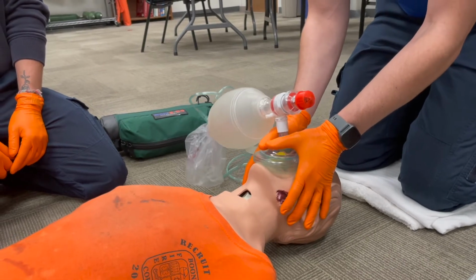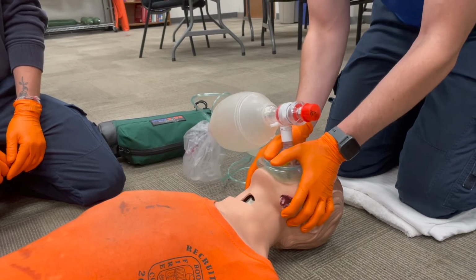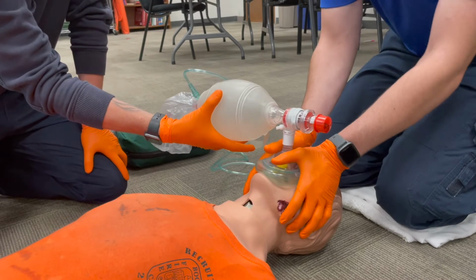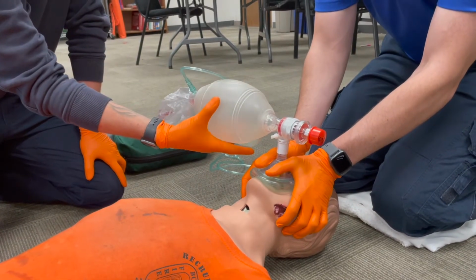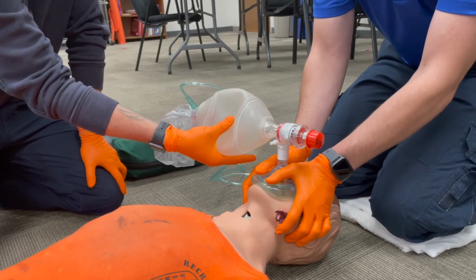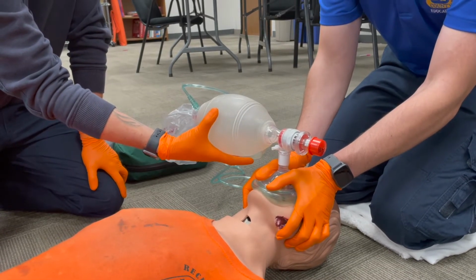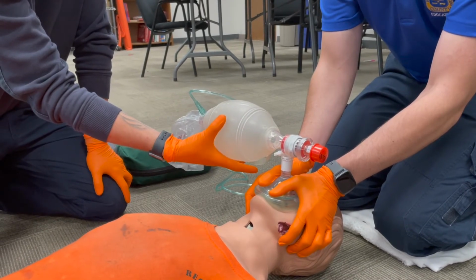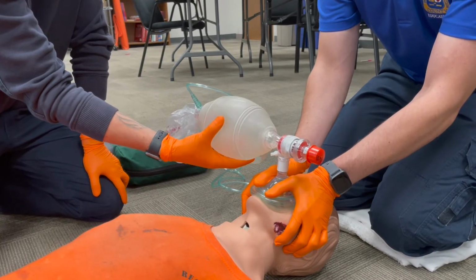So you're getting kind of 2 benefits in one here. You've got a jaw thrust as well as you're getting mask seal. So then I'm going to have my partner squeeze the bag. The person holding the mask is never going to be squeezing the bag. And we're going to do 1 breath every 6 or so seconds for an adult. And that'll look something like that. Obviously, you're going to have your BVM connected to oxygen at 15 liters per minute. And we're giving about a half a bag full, squeezing it nice and slow with 1 hand.